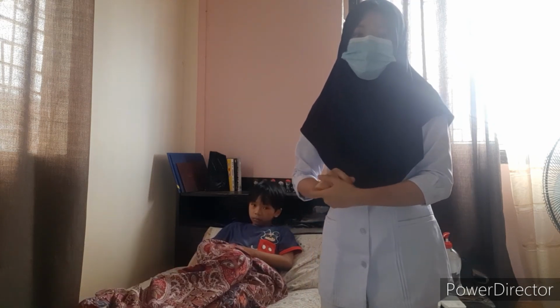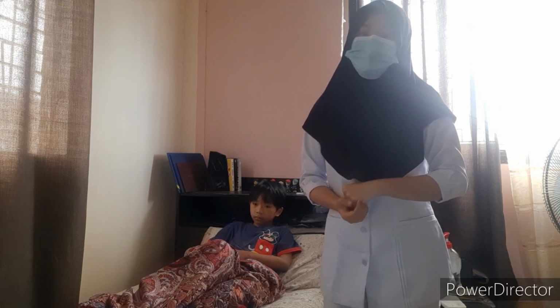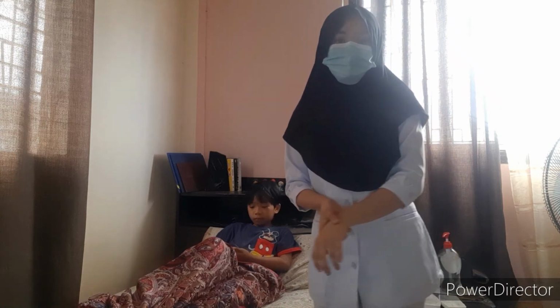Record the reading according to the institution's policies. So this is to obtain the additional data according to the rules.